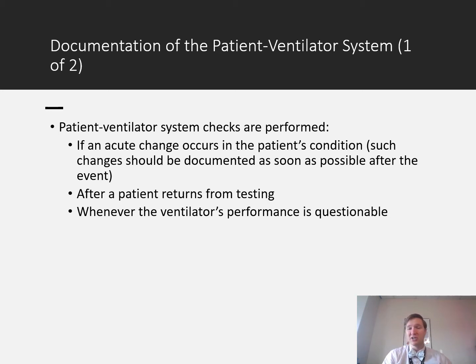What if a patient returns after testing? Let's say they go to a CAT scan, they go to interventional radiology, they go have a procedure performed in the OR, and they come back. Well, we should do a vent assessment when they come back, even though they're not scheduled to have one yet, just to show where they were at when they got back.